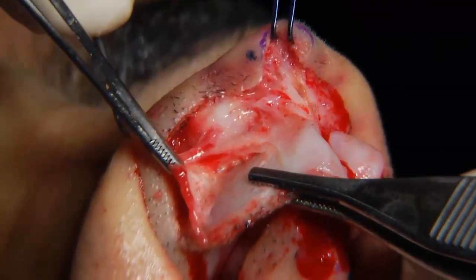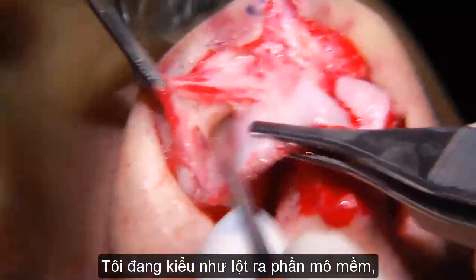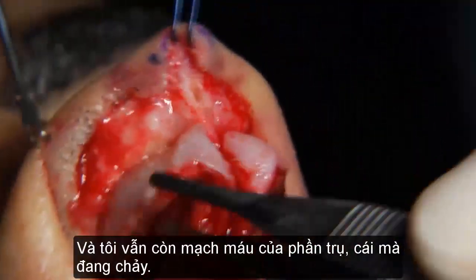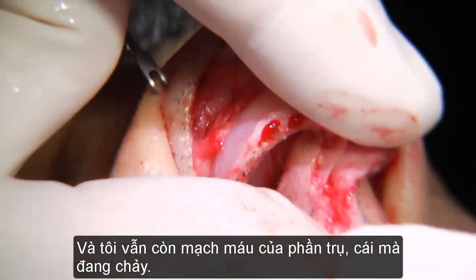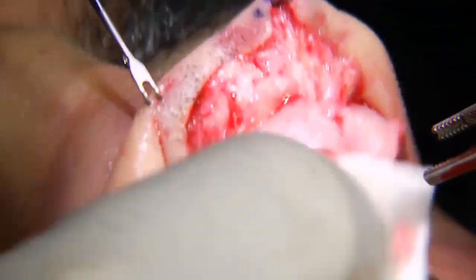Whatever you want, even the teeth now. I peel off this soft tissue. So I'm not really subperichondrial, but I'm almost subperichondrial. And I still have this columellar vessel, one of them, which is fighting. Okay, pressure.